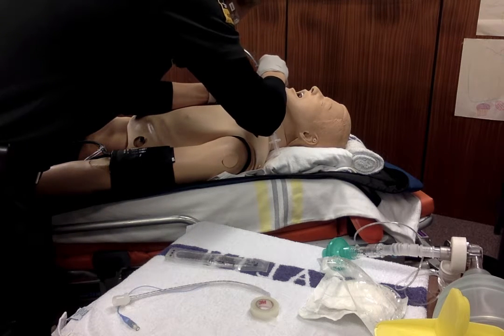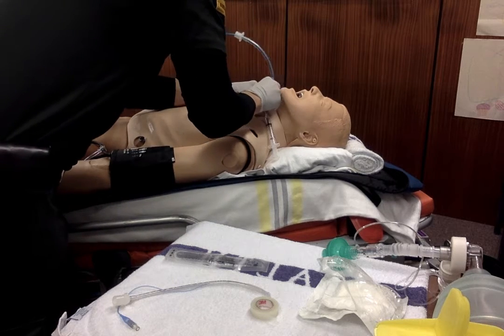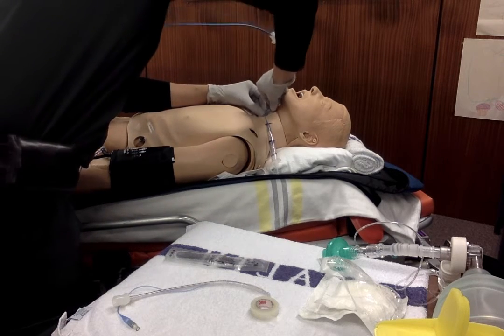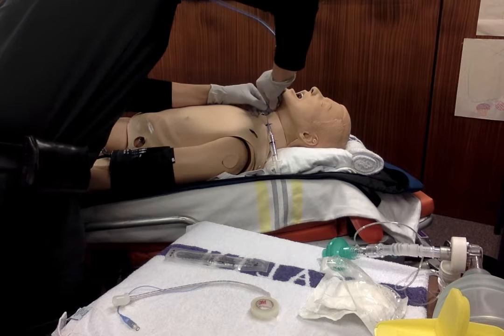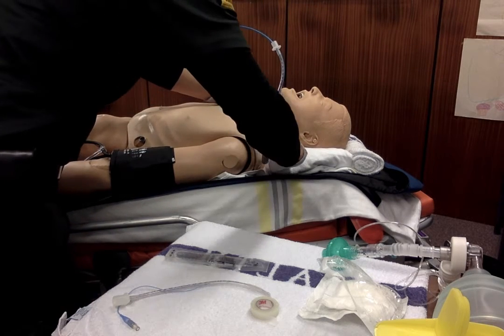And as you go through the opening, pushing it down, you want to get the cuff through the gap. This one's a little on the sticky side. And 1 or 2 of the black lines through the gap would be ideal also.